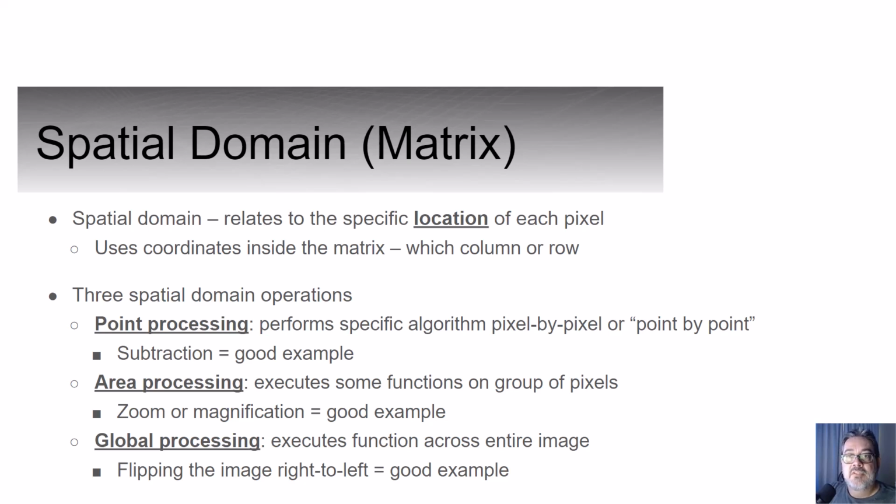Remember, an algorithm is just a set of instructions for the data, once it's captured, to be manipulated. For example, each body part and projection you have options for selecting have algorithms associated with them to tell the computer how to display the image. So if I select PA chest X-ray at the console and perform a PA chest view, that assigned algorithm expects pixel values to reflect the high subject contrast and adjust the image to look a certain way based on the preference of whoever designed the algorithm.